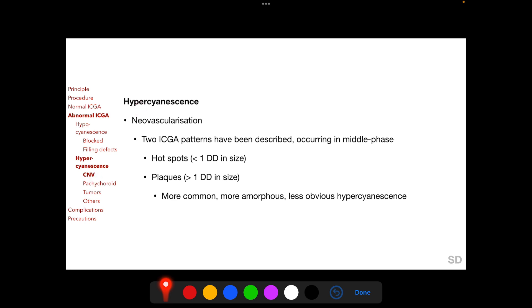Hypercyanescence on ICGA can occur with macular or choroidal neovascularization, pachychoroid, tumors, and other situations. Macular or choroidal neovascularization shows two patterns of hypercyanescence in the middle phase of ICGA: a hotspot, when the area of hypercyanescence is less than one disc diameter in size, and a plaque, when the area is more than one disc diameter in size.